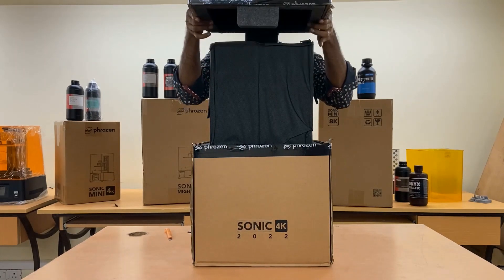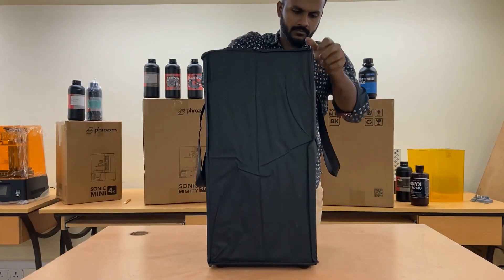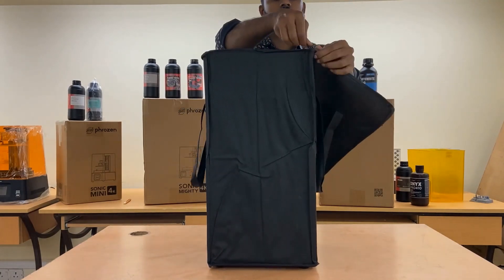It works and is compatible with the majority of scanners, slicing software, and resins. Superfast 3D prints are produced and delivered in an hour or less.